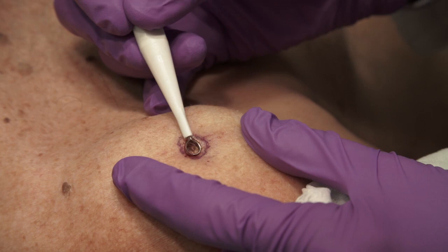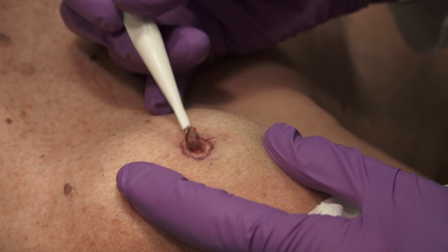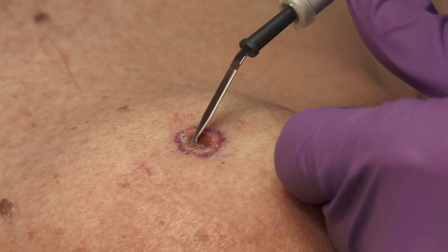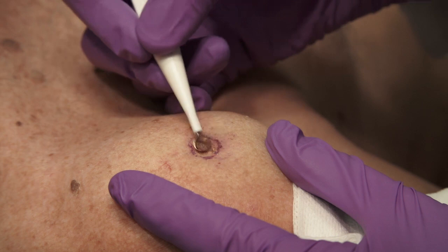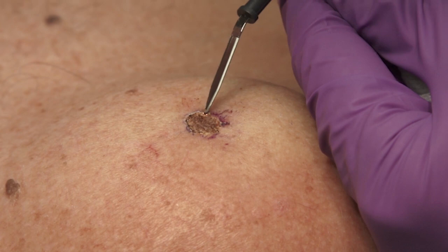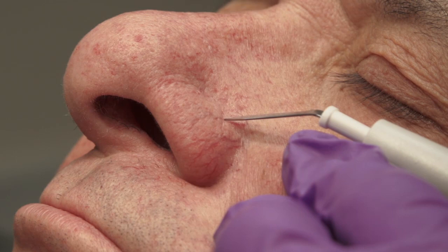The curette is employed again, making sure to use it in multiple directions. Electrodesiccation is performed going back and forth across the affected area. A curette is used once again in all directions, including the edges of the tumor. Final electrodesiccation is performed, with the last step including circumferential electrodesiccation around the entire tumor.